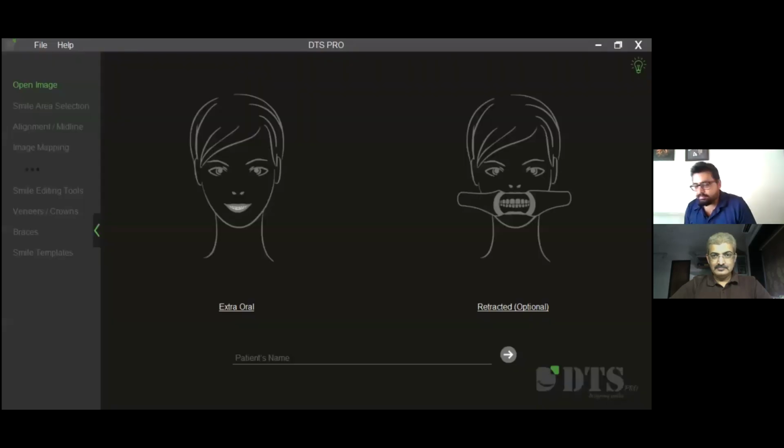Thank you, sir. Thank you for having me here. Let me just quickly share my screen. Right. So, as sir has already introduced, I am primarily a practicing orthodontist, and I am a clinician. Just before I go into the software per se, I just want to share a small bit on what exactly made us go through this line and try developing a software.